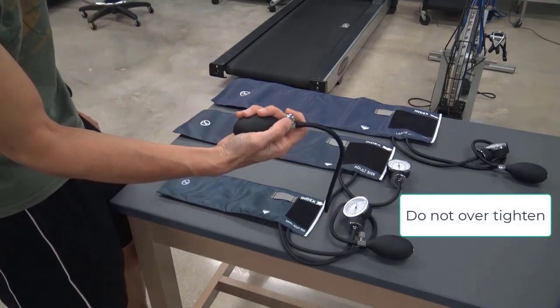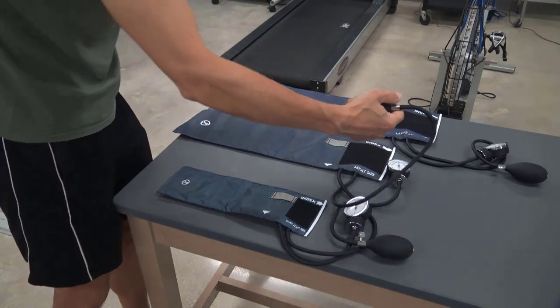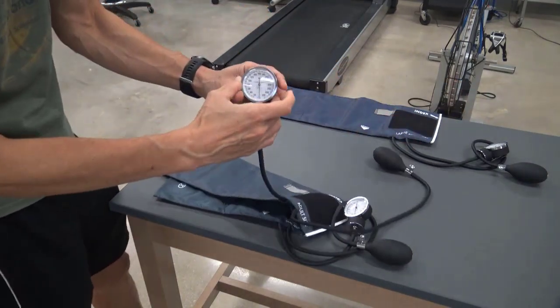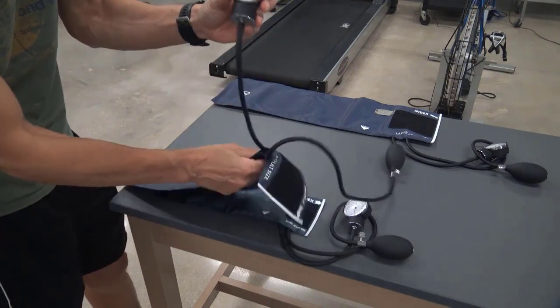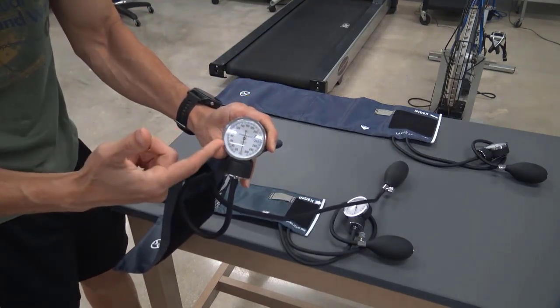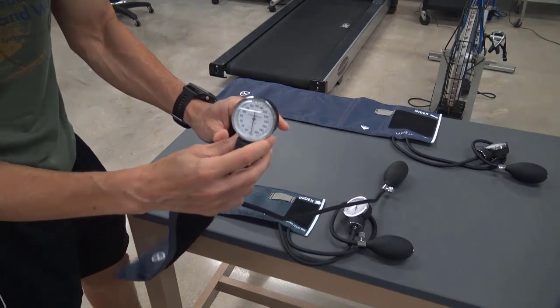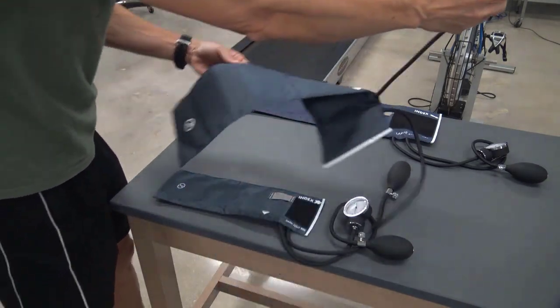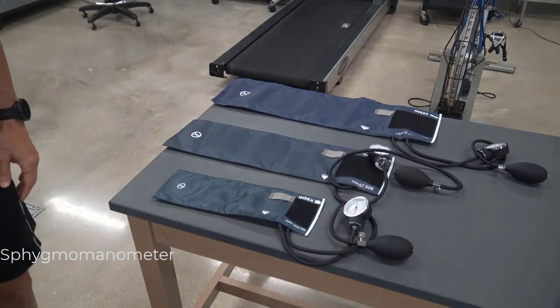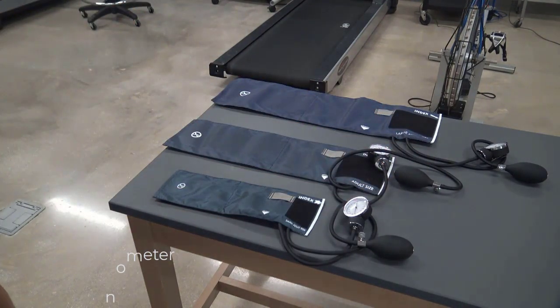One common mistake I see students making is that they try to make the valve too tight. You just need to tighten it until it stops. In the other tube we have the aneroid gauge — that's the needle that points to the numbers as it's inflated and deflated. These numbers are in units of millimeters of mercury, and you will note that they are in increments of 20, with the larger lines in increments of 10 and the smallest in increments of 2. This whole thing is called a sphygmomanometer.